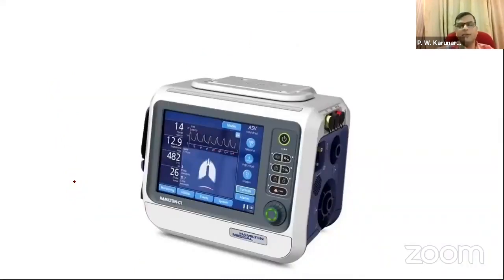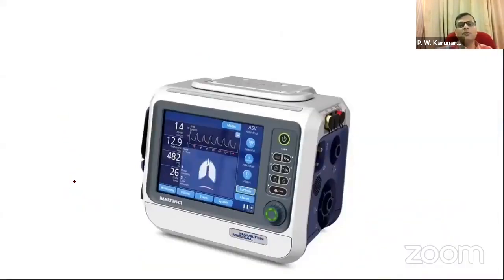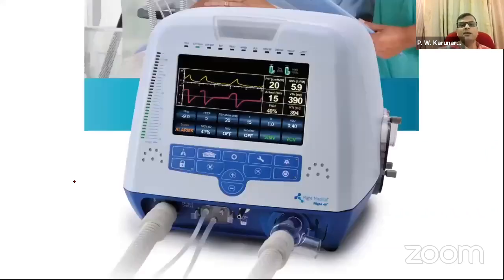So this is another portable ventilator we have in Sri Lanka, Hamilton Medical. It's kind of an advanced one. Probably you can do all ICU ventilation with this portable ventilator. That's what I do in my ICU. And this is another portable ventilator. Once again, you set the mode, SIMV volume control, then oxygen, tidal volume, things like that. You can change all these values and then start ventilating with the ventilator. You will have to learn your ventilator, but these are the settings.